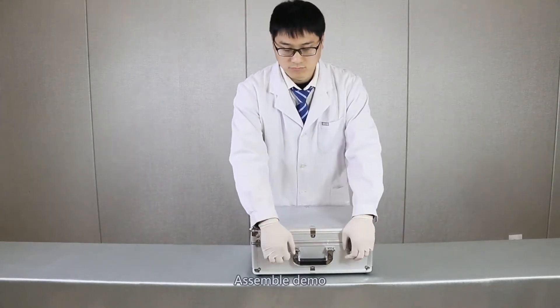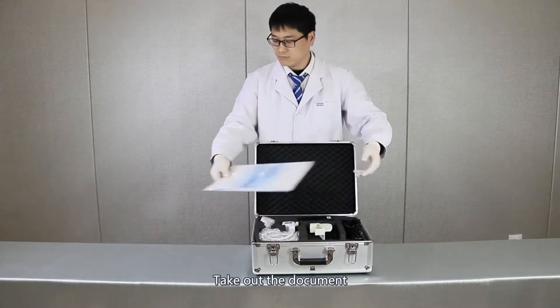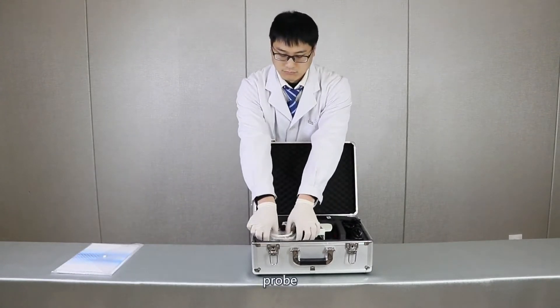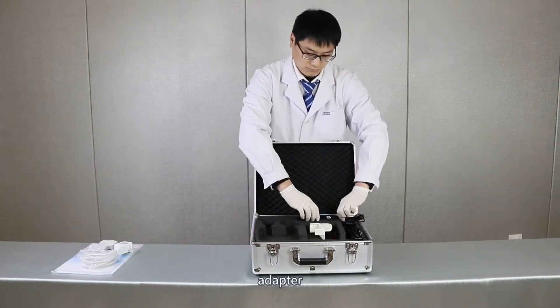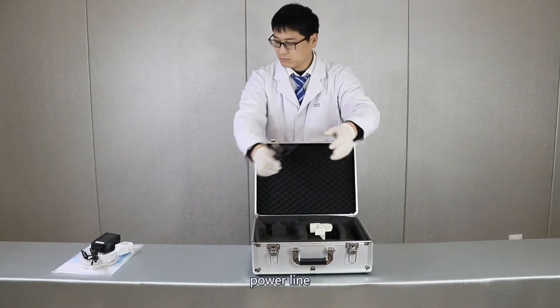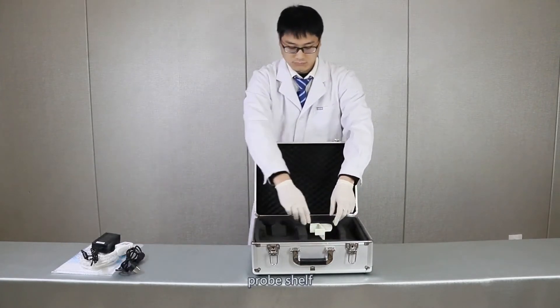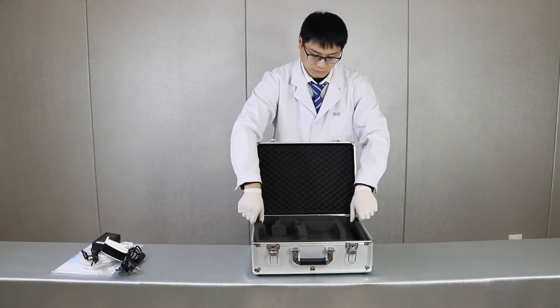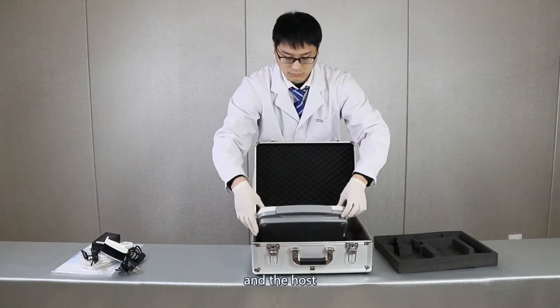Assemble demo. Open the packing case and take out the document, probe, adapter, powerline, screwdriver, probe shelf, and host.